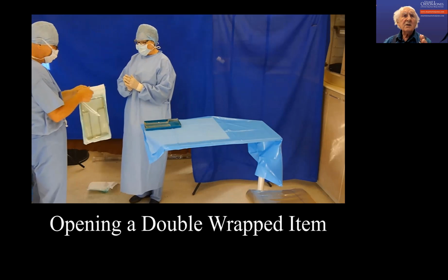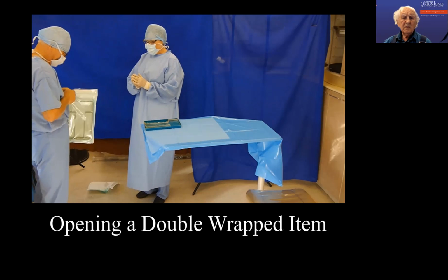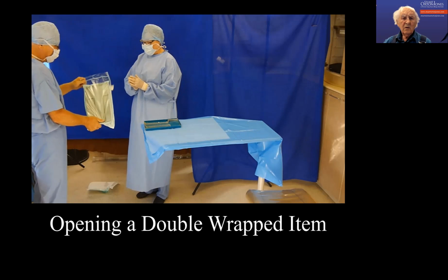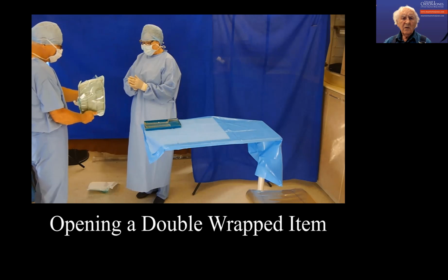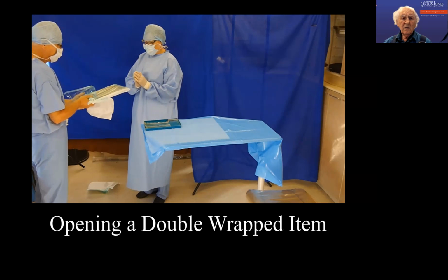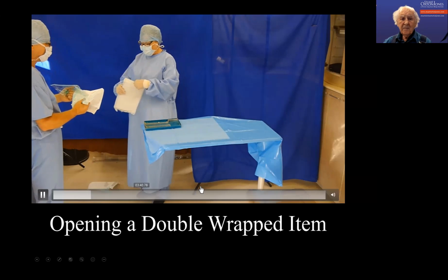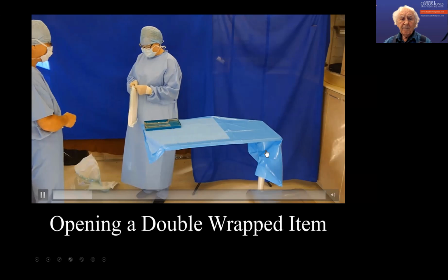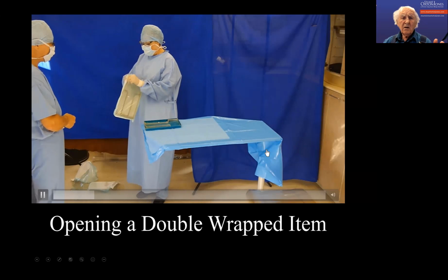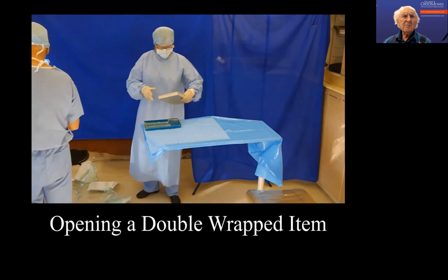You notice she's got her hands in the praying position, so her hands don't go all over the place. And the used paper is thrown on the floor. That's picked up later.